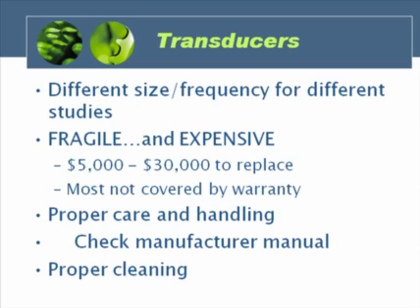Remember that transducers are both fragile and quite expensive. Transducers may range anywhere from $5,000 to $30,000 or more to replace, and many transducers are not covered by a warranty, especially if they consider the damage to be from dropping the transducer. Make sure you check your manufacturer's transducer manual for proper care and handling, and most importantly, proper cleaning of the transducer.